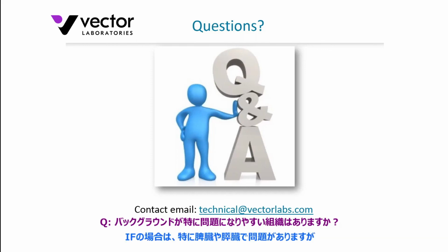For immunofluorescence, yes, some tissues, particularly spleen, are problematic, pancreas as well. TrueView does quench the autofluorescence in those tissues, but certainly some tissues tend to be a little more antigenic, I would say, and that would be seen mostly with frozen tissue preps compared with if it was paraffin embedded. But yeah, certainly some tissues tend to be more problematic. Degrees of vascularization and the protein expression that they have, yes.